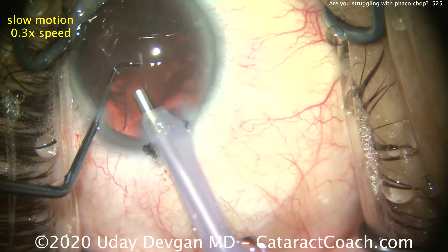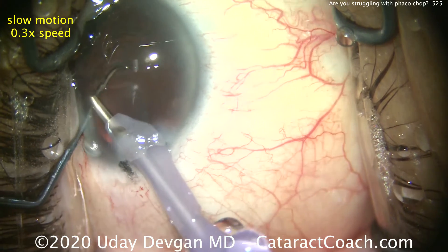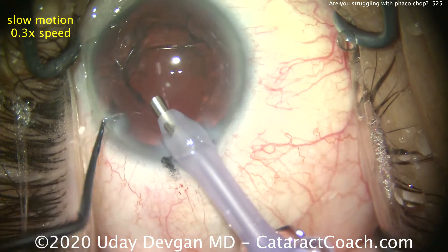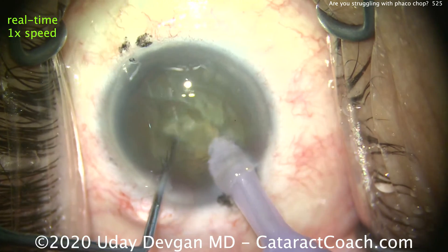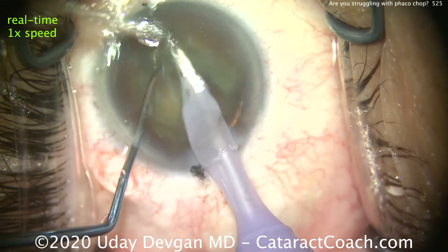But to really hammer home the point, I think it's helpful to see that same video clip again, but now in real time, so you can see how things really happen. So let's watch it one more time — this is real time now. Buzzing with both instruments, chop, propagate it, separate the pieces, really get a good separation.